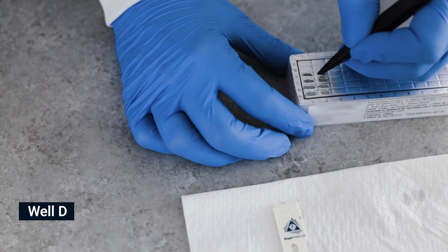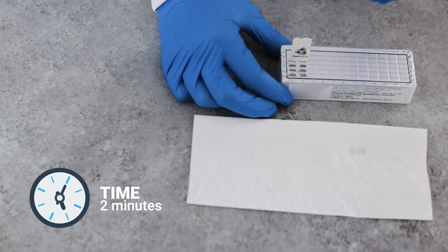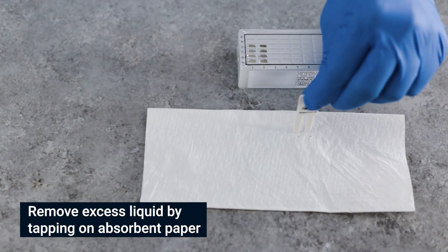Pierce the foil of the next wells in row D. Shake off excess liquid and insert the comb for 2 minutes. Move the teeth at least twice during this step, then remove excess liquid.